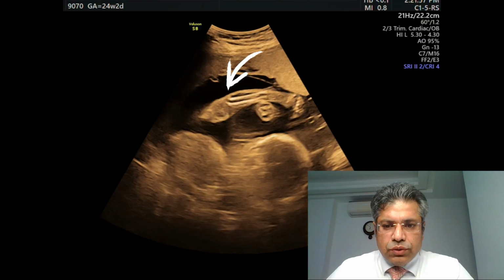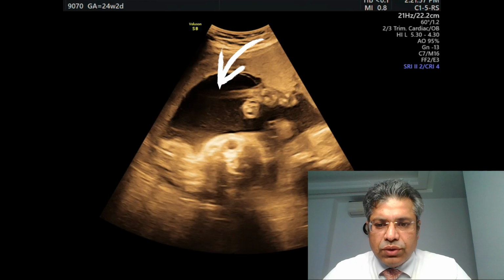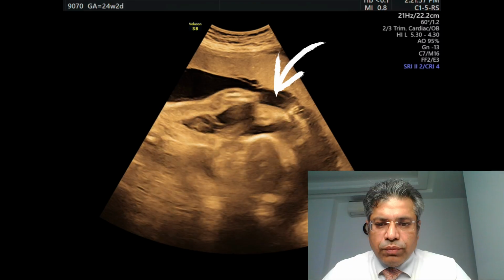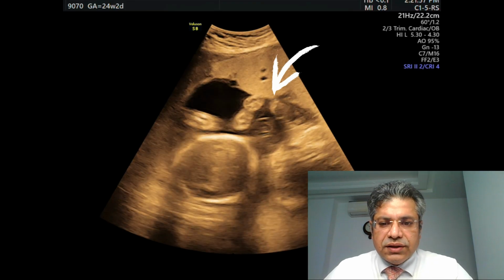Now look around carefully at this fetus. Hyperextended knee joint. So bilateral, दोनों तरफ ही hyperextended knee joint है. Now try to look around for the feet. And then the feet is also slightly, है ना, club foot, mild variety of a club foot. Very mild sluggish movement of the baby, even though I'm trying to stimulate the baby. And then with the polyhydramnios, the baby is tanking.